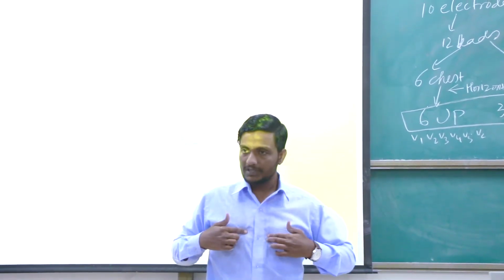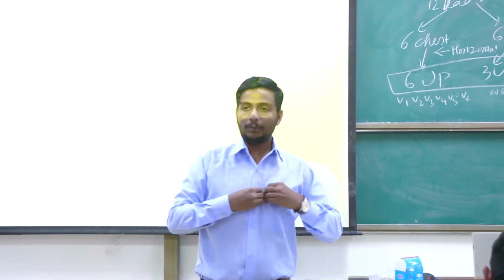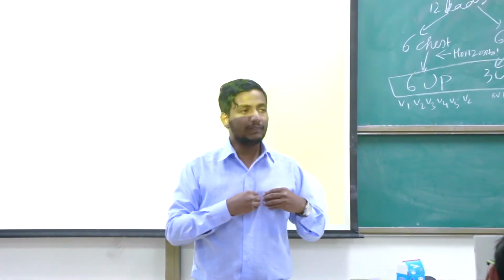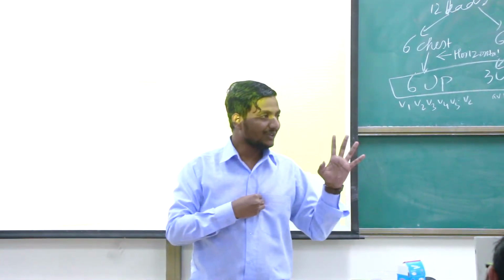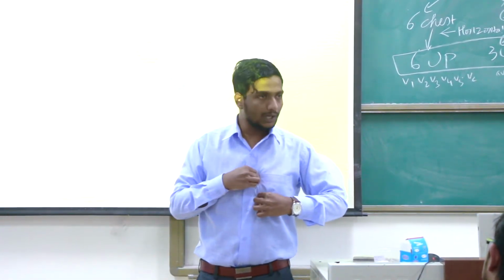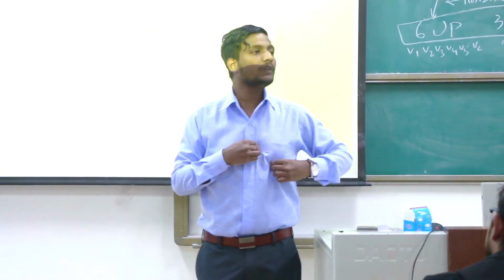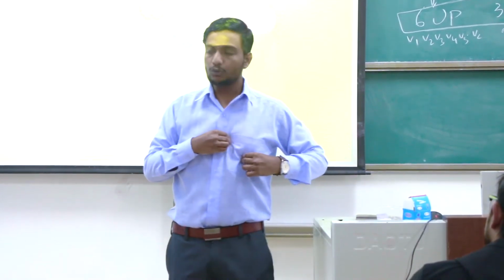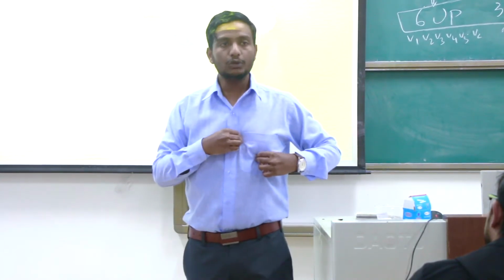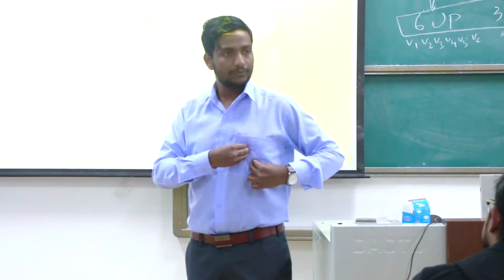In the same intercostal space on the left side, which one are we going to place? V2. Right? So we have placed V1 here, then V2, and then we are not going to place V3. Keep in mind, we are going to place V4. We'll go one more intercostal space down, the 5th one, and then to the mid-clavicular line. So here will be somewhere for V4. After placing V4, we'll come back for V3. V3 will be at the midpoint between V2 and V4. So it will be somewhere here. It's going to be V3.